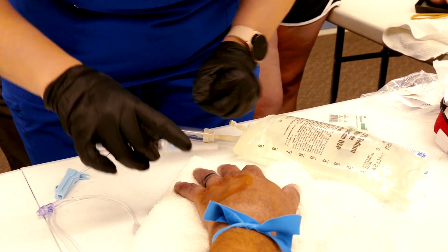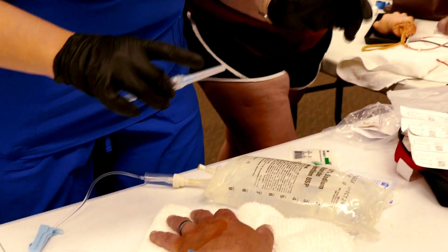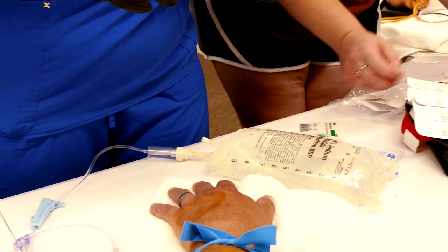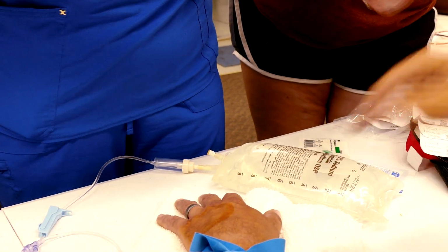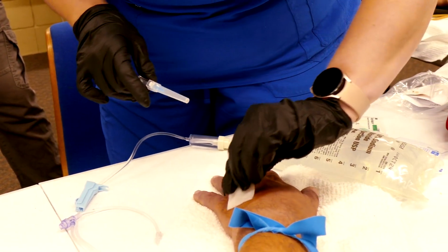Now you just contaminated my finger because you didn't clean off your glove first. You didn't clean your finger. Yeah, you're right. There's extras on the side of the kit there. Yep. So now you've got to re-cleanse myself. So this is really cool, but it is not trivial. There are implications for a lot of this stuff.